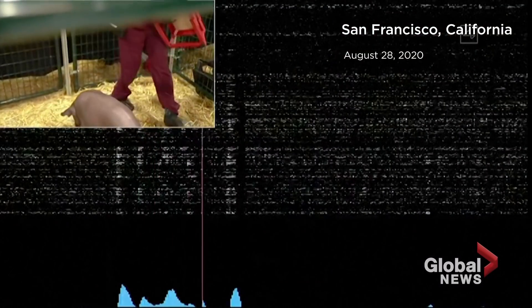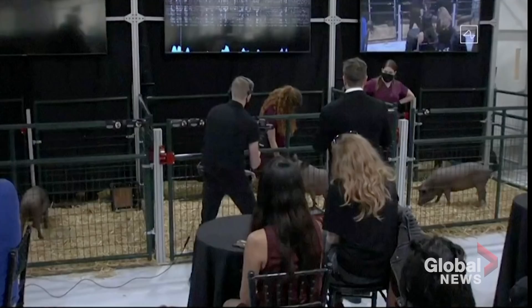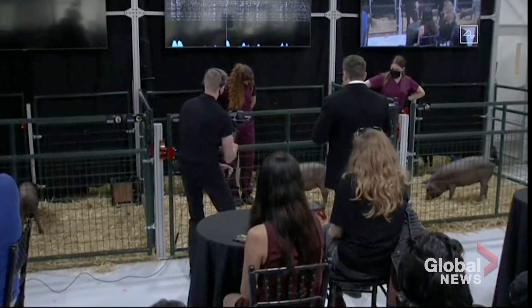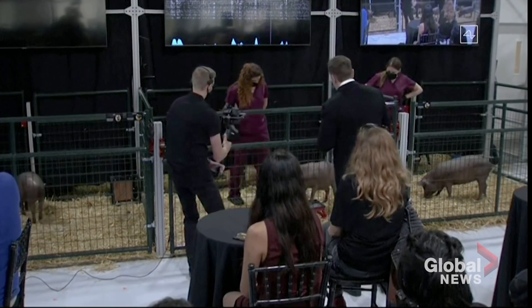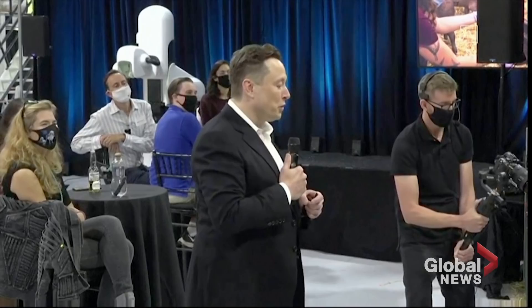This is a high energy pig. Gautry, thanks for coming out. The beeps you're hearing are real-time signals from the neural link in Gautry's head. This neural link connects to neurons that are in her snout, so whenever she snuffles around and touches something with her snout, that sends out neural spikes which are detected here. We have a healthy and happy pig — initially shy, but obviously high energy and kind of loving life — and she's had the implant for two months.